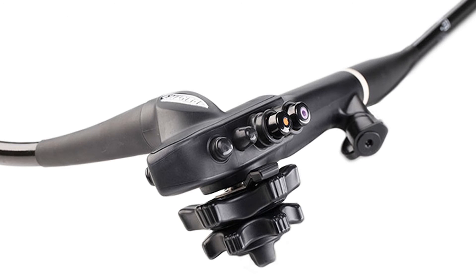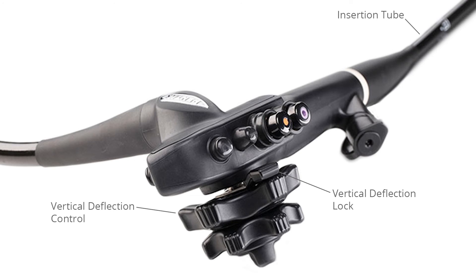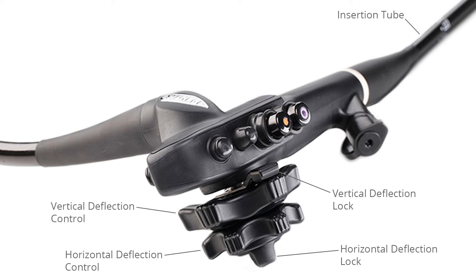Typical components at the proximal end include the insertion tube, which is the long flexible section of the endoscope that is not steerable. The vertical deflection control and lock allow the bending section to be steered up and down and locked in place. The horizontal deflection control and lock allow the bending section to be steered left and right and locked in place. There is also a working channel port and elevator control, which allows the angle of the elevator to be adjusted to set the angle at which instruments exit the working channel. This control is typically only found on certain types of ultrasound endoscopes.